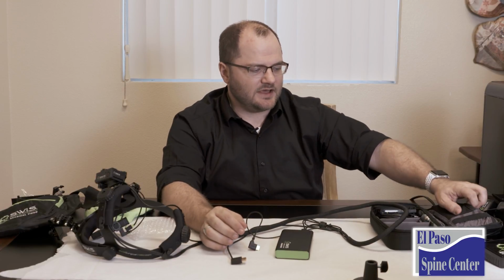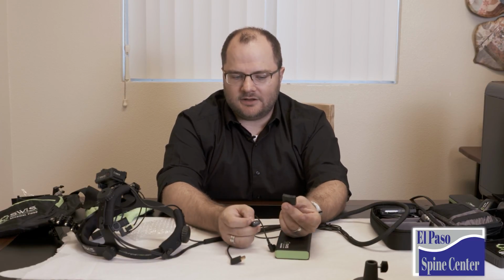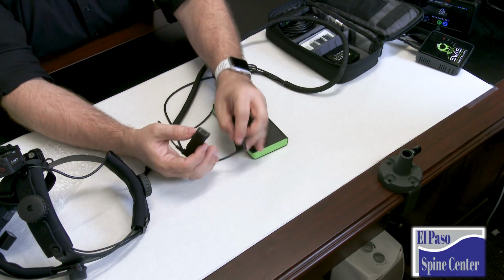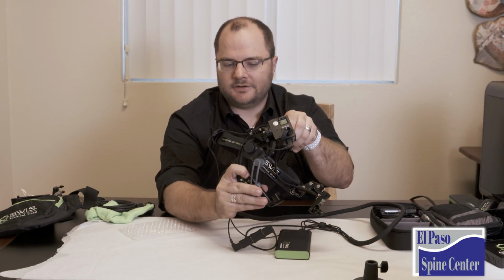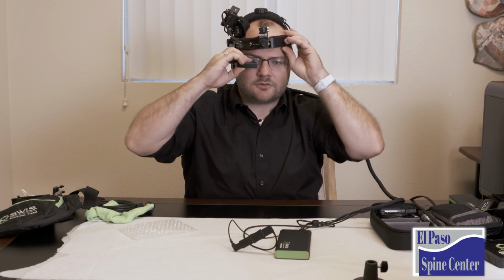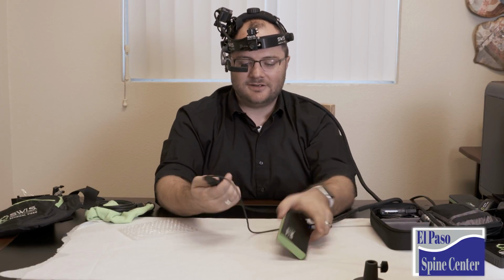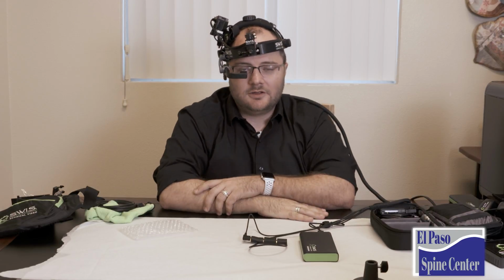Now remember, in our case, we actually have a mini to full size HDMI and a female to female adapter. We can actually take these, plug in the adapter, plug that into the female to female, plug that female to female into the GoPro, turn on our Viewfind. I'll have to show you what the Viewfind looks like. I'll have to figure out a way to get a video of that. But when we turn this on, I can now actually see what the GoPro is seeing, which right now, nothing's being recorded. We could hit record on the GoPro up here and record to our GoPro, and we have a complete system.